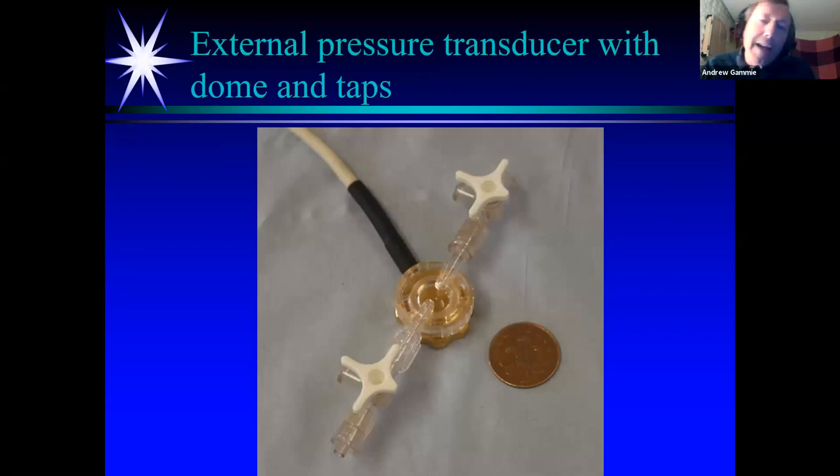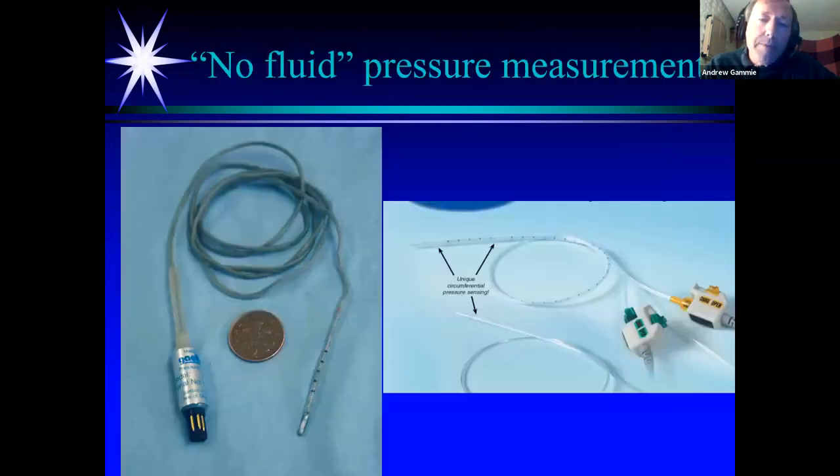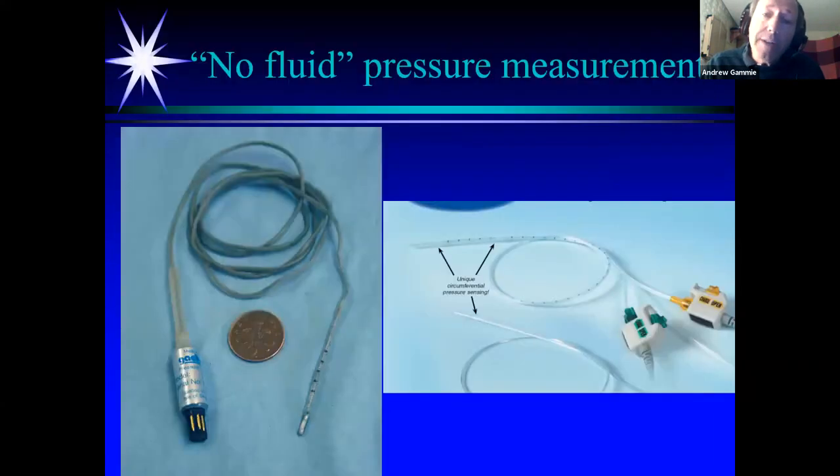So when we look at pressure in urodynamics, we use transducers to pick up that pressure. It's rather easier than working with columns of water and trying to measure how high they are. So our transducers are connected through a column of fluid, and under your transducer surface, you've got one of these. It's a strain gauge. A strain gauge will bend according to the amount of pressure on the surface of it. And it doesn't matter what kind of transducer you have, actually. These other ones, there's an air-filled one, and there's a microtip one here on the slide. They all have strain gauges in them.